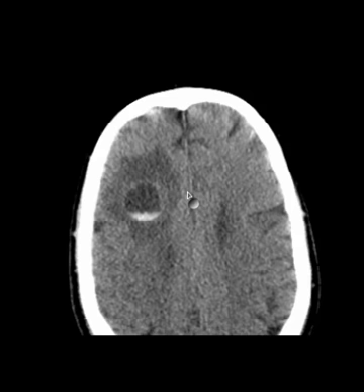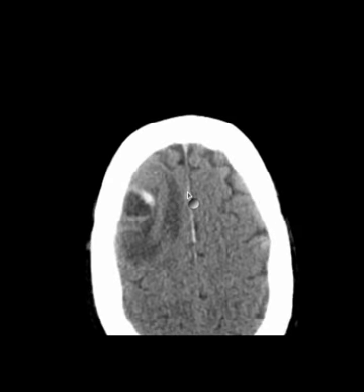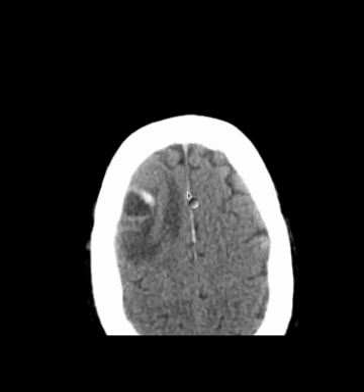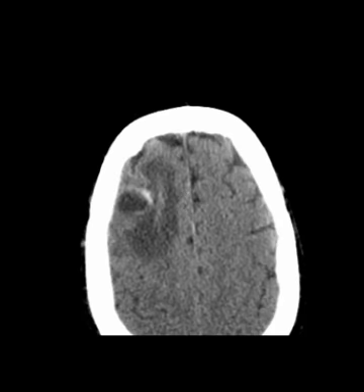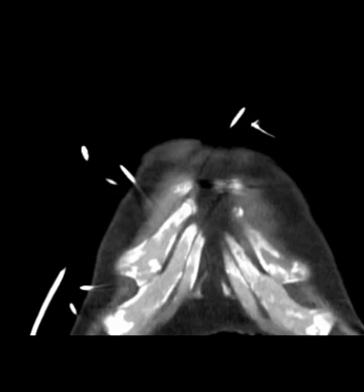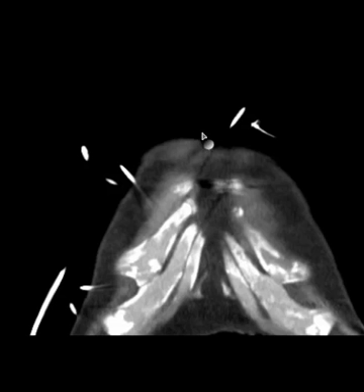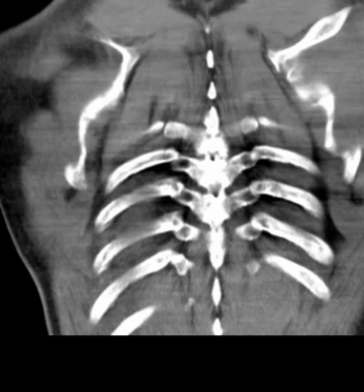Well, a chest radiograph was done and it was abnormal. And so they went to CT. And here is the chest CT.